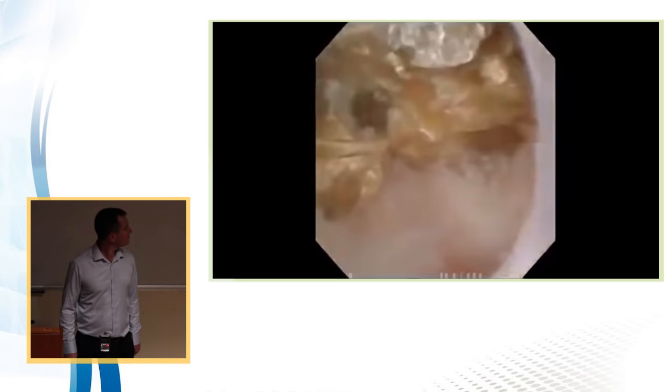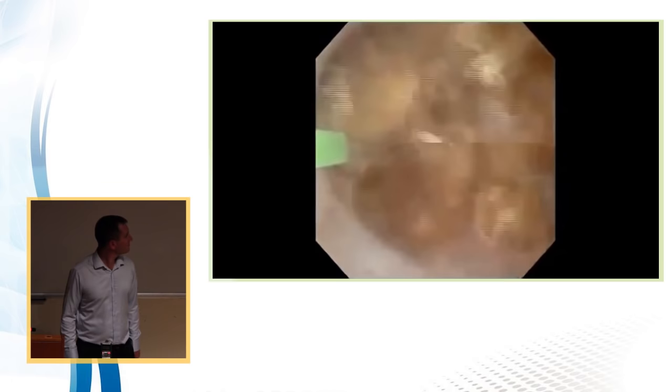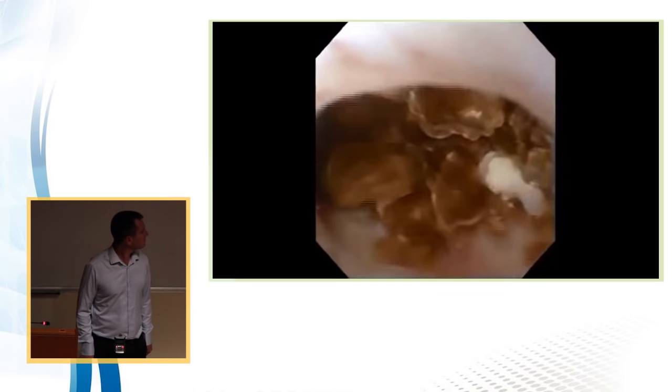But you do want to be aware the patient's obviously breathing, and that adds a layer of complexity because the kidney is moving. You use slow, subtle movements to paint the surface of the stone and try not to crack the stone in half and try not to bury the tip of the fiber into the stone. Because you're using such a low energy setting, each hit of the stone is not as powerful.